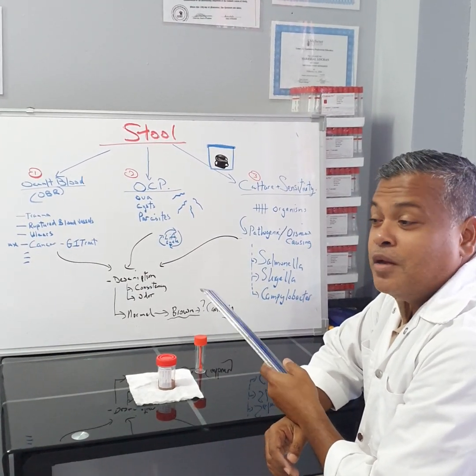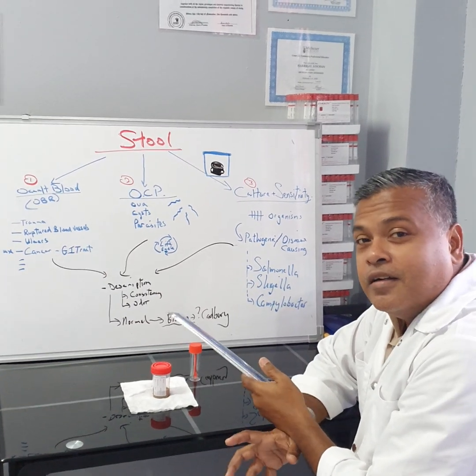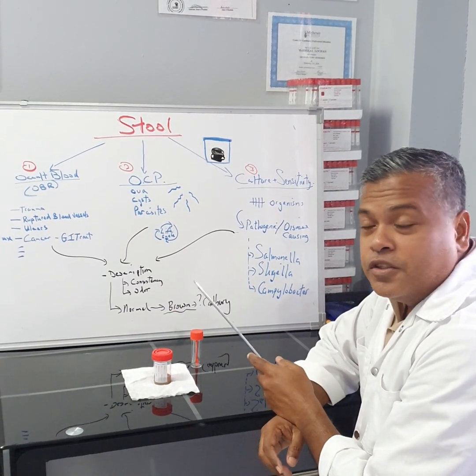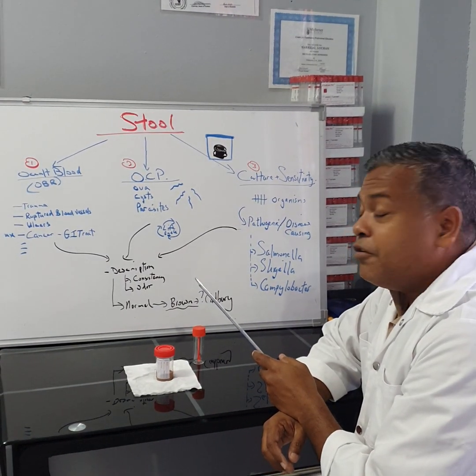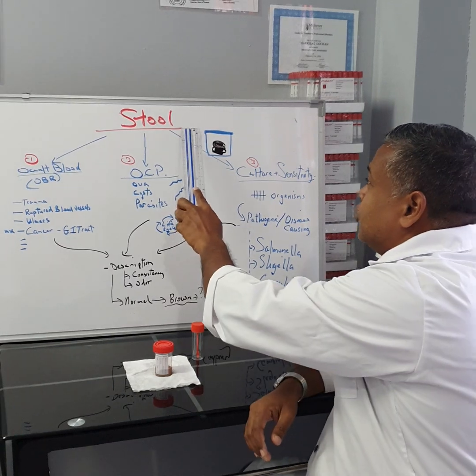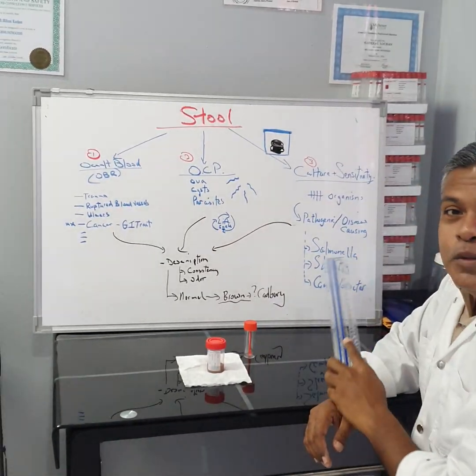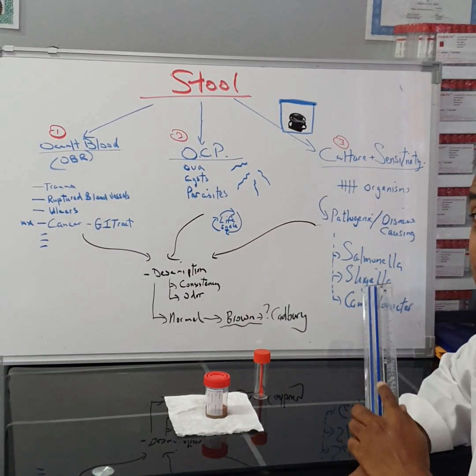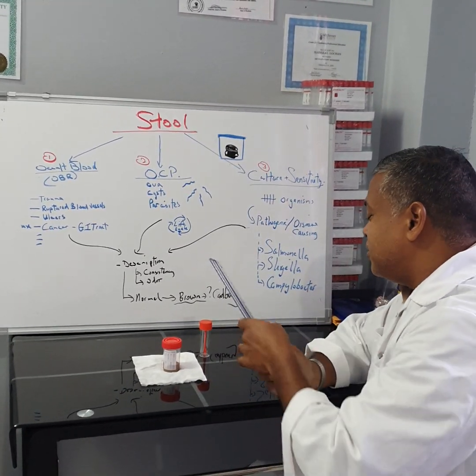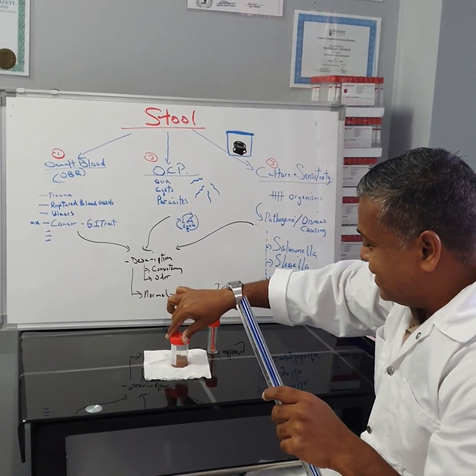Mr. Lochan here at Medical Scientific, and today we're going to talk about a specimen that we get quite often in the laboratory, but it's not one of the finer specimen types. But nonetheless, as medical technologists, we are required to test samples, and this here is one of them. I'm talking about none other than stool samples, or what we call feces. And I've got a little diagram here with a specimen cup that has a sample in it.